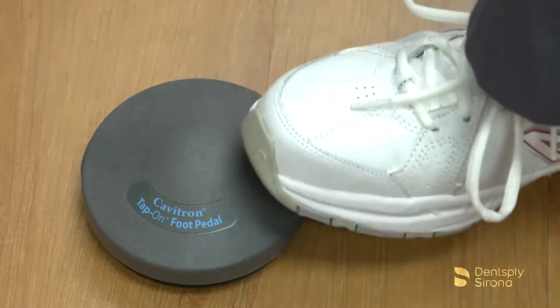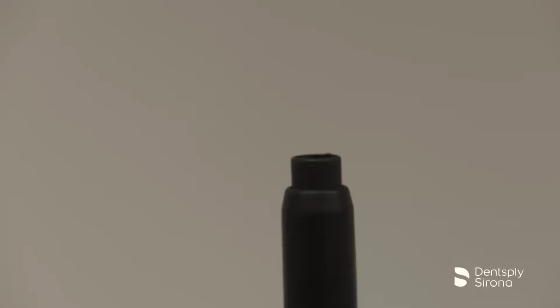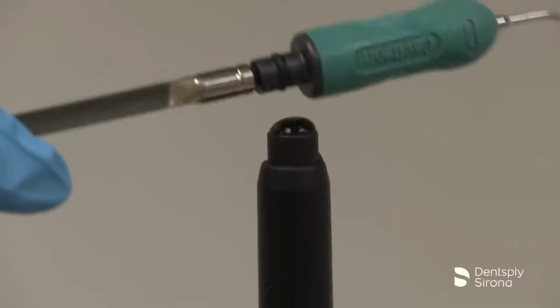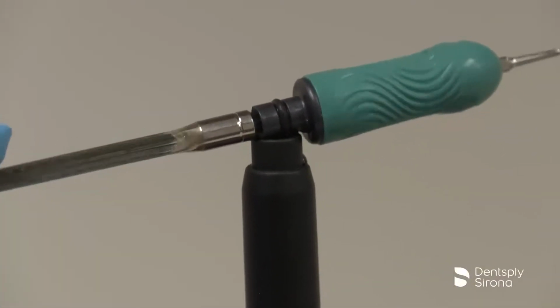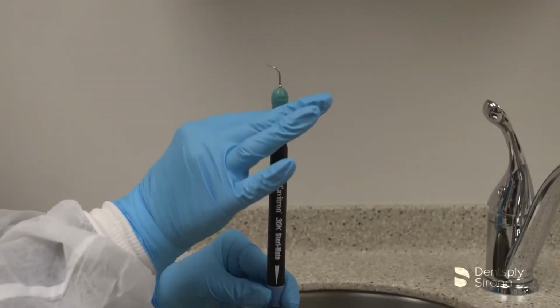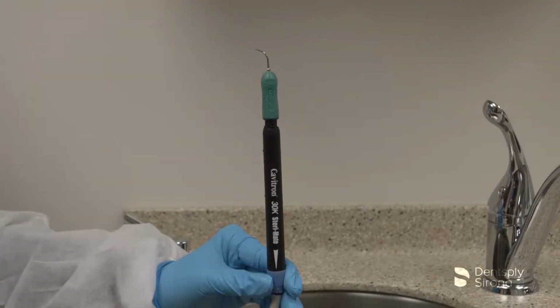or drain. Depress the foot pedal until water exits to release any air bubbles that may be trapped inside the handpiece. Lubricate the O-ring on the insert with water before placing it into the handpiece. Fully seat the insert with a gentle push-twist motion.